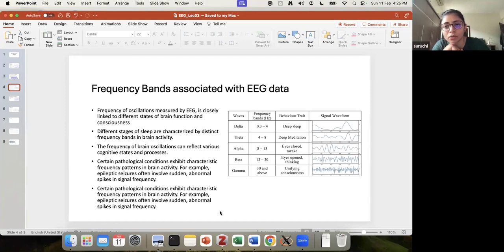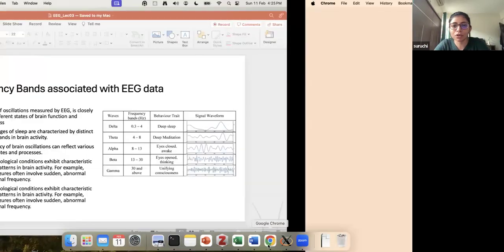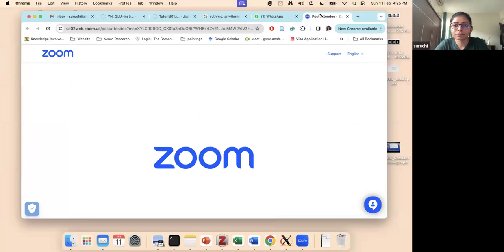They don't have access to all the sophisticated coding, no? So they get these printouts on a sheet. In that printout, they will have the 1 second windows marked. In fact, the earlier EEG didn't come with computers. EEG was even before computers, so they used to be just printouts. You've probably seen those red sheets with raw EEG signal. I can Google it and show you.